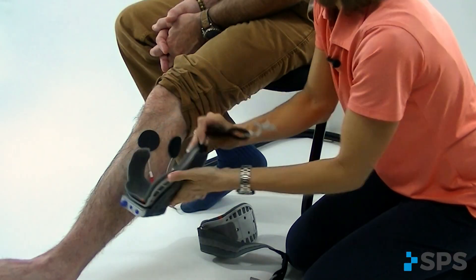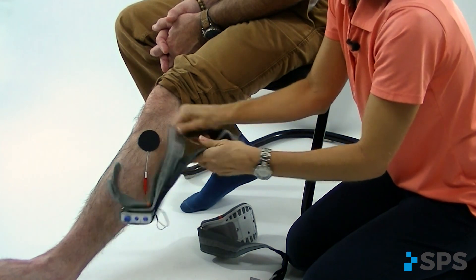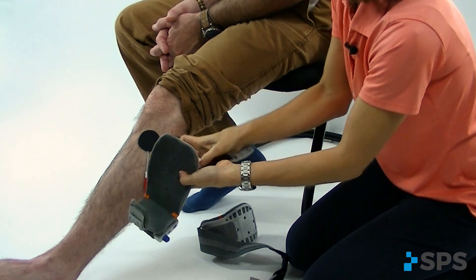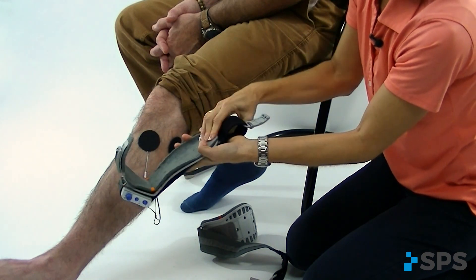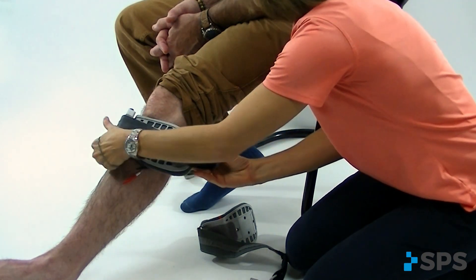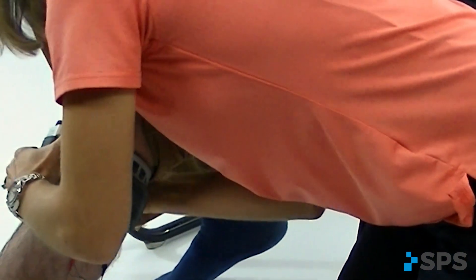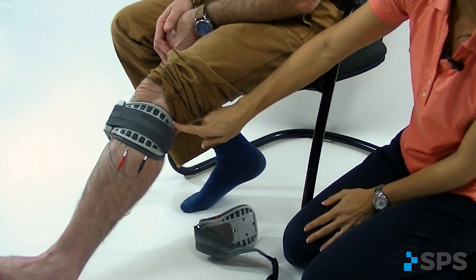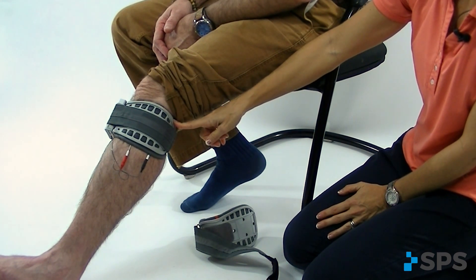You're probably going to have to make that cuff strap shorter. That's what this Velcro piece is for, so that you can still have that cuff strap secured. When you put the cuff on, you're now capturing the electrodes completely, and there's nothing sticking out for air to get between the electrode and the skin. You'll get a better response.